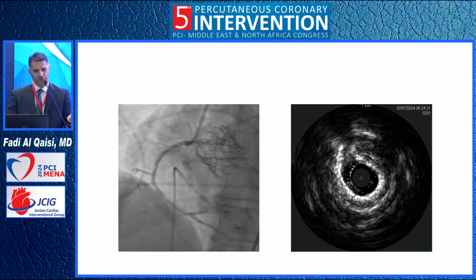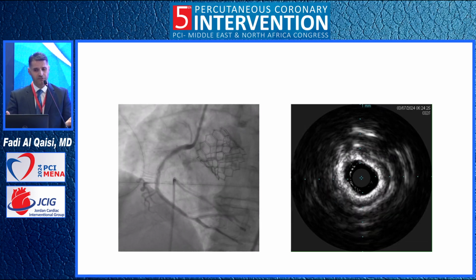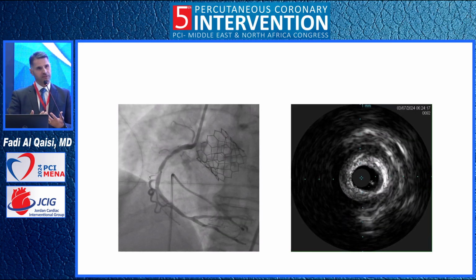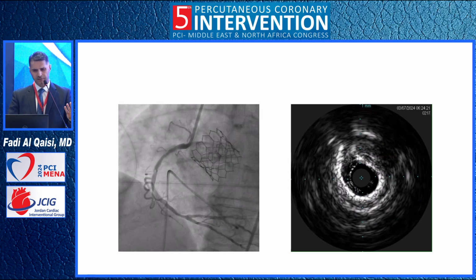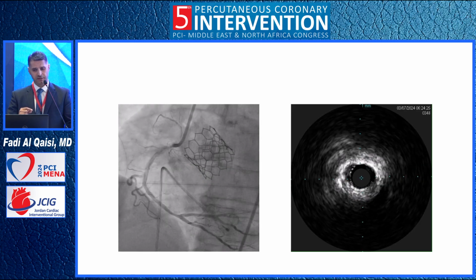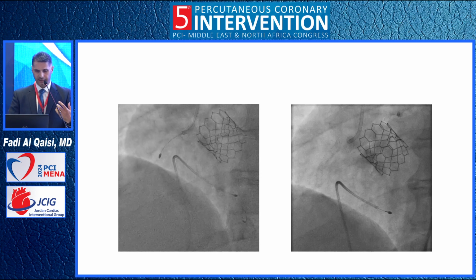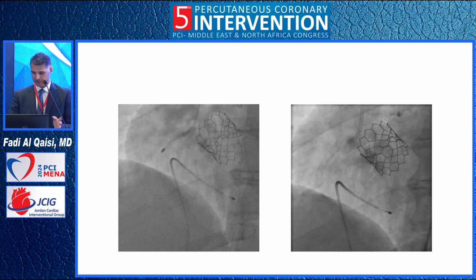And indeed, I did rotational atherectomy for him, and at the end I got relatively nice results with good expansion of the stent. Again, speaking of complications, it's not always nice results. This is a patient I did rotational atherectomy for. I ended up with some no reflow. Finally, I got decent results at the end, but yet, they were very rough 30 minutes.